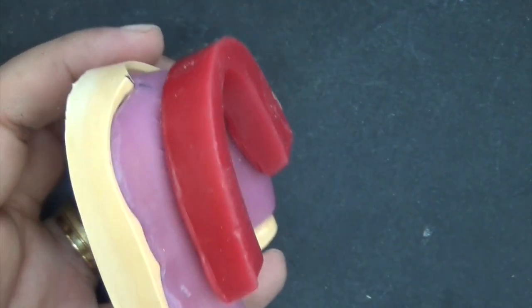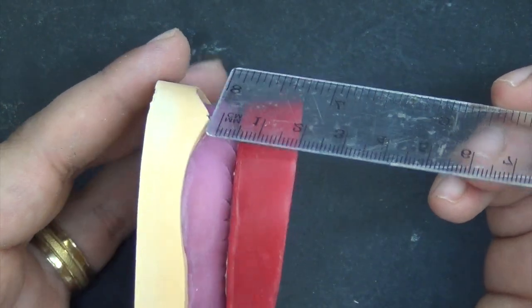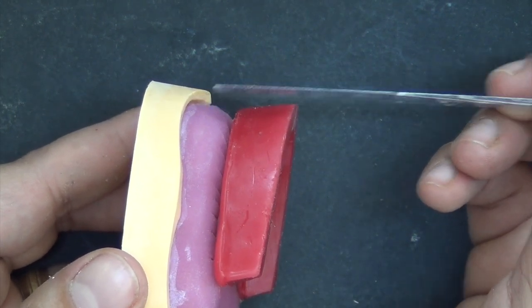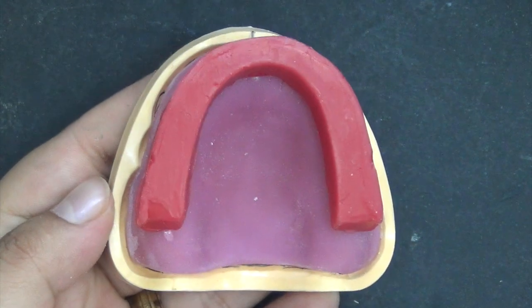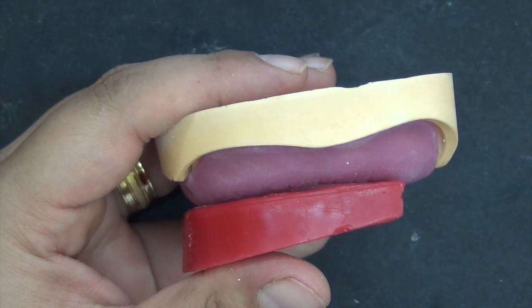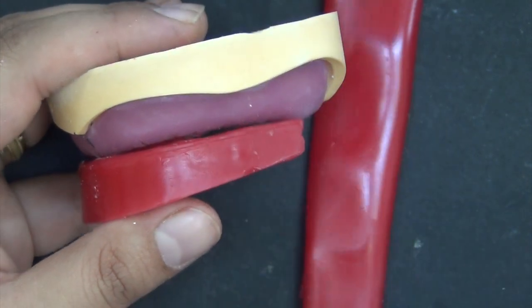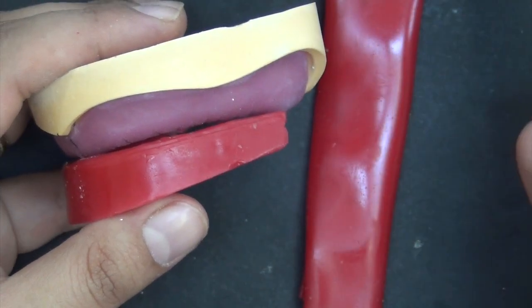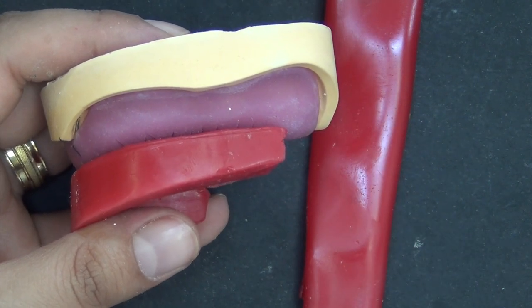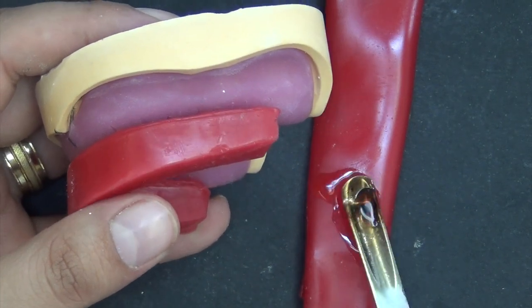Note that, as we mentioned earlier, the labial surface of the rim falls on a line that drops from the sulcus perpendicular to the occlusal plane. Once the rim is correctly positioned, it is ready to be sealed to the base. Use the spoon end of the wax knife to soften the base plate wax and gradually drop it into the space between the rim and the base.